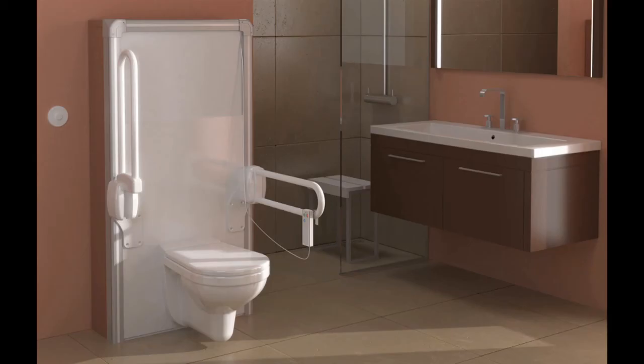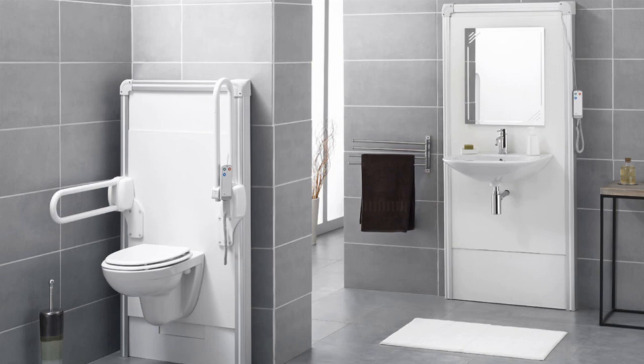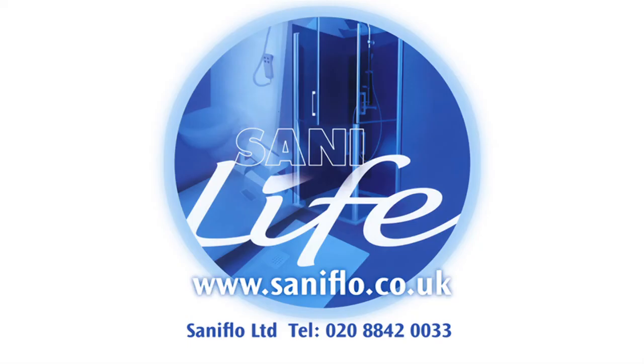So the SaniMatic WC and wash basin offers you adjustability without sacrificing aesthetics, and they are completely unlike other quasi-medical equipment, which was previously your only option. You can find all the details of the SaniLife range, including SaniMatic products, together with the Saniflo domestic and professional ranges of macerators and pumps, on the website www.saniflo.co.uk.